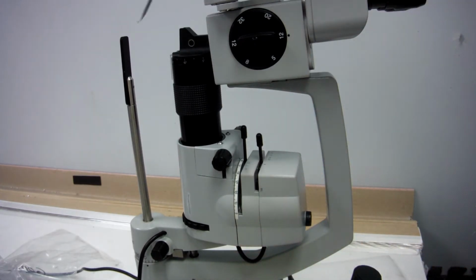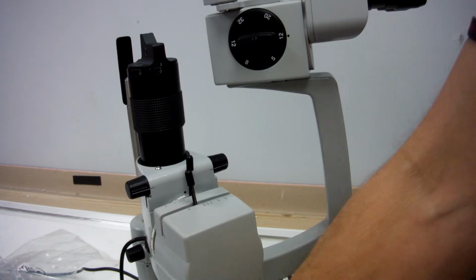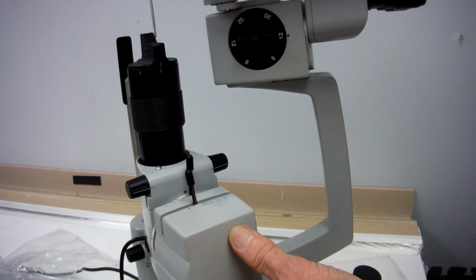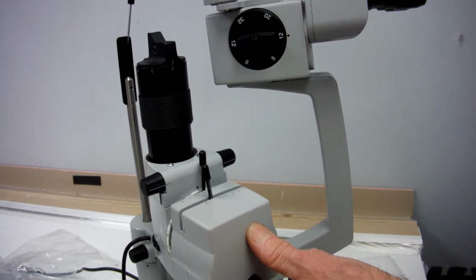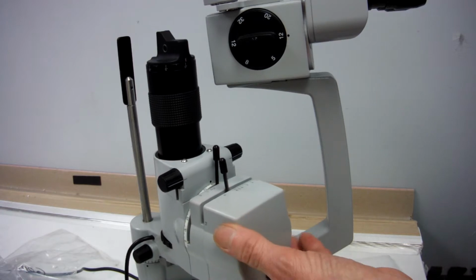If it needs to go up or down, there's another screw right here in the center that you'll need a small screwdriver for, right there on top of the hood. Screwing it up or down will make the image go up or down. So those are some simple little tweaks to get your image right in the center of the focusing rod.